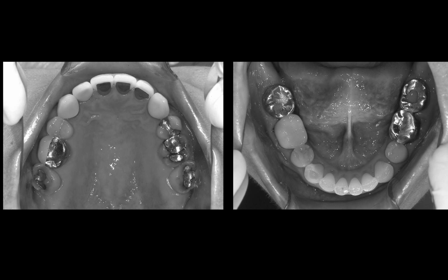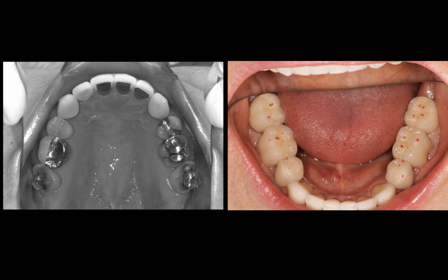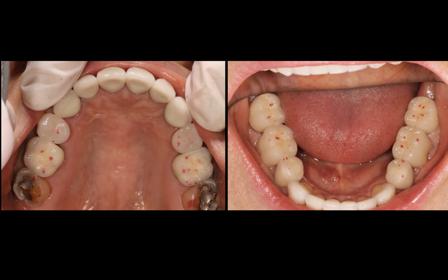So this is going to be a vertical dimension case. And again, I started and I did this segmentally. This is how most of dentistry is done. I started with the lowers and completed the lowers. I opened the vertical and I got my correct occlusal plane. I came back later and I did my maxillary anteriors. I set up my lines, my disclusion. And I finally came back and finished some of the maxillary posterior teeth. I did not complete the second molars. I will do that at a later time.